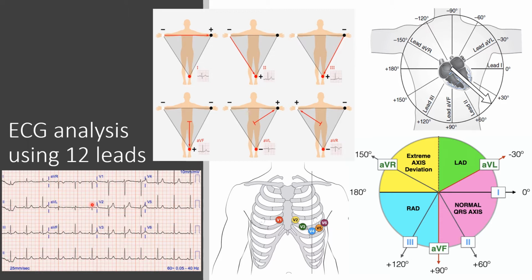The EKG can actually give you all of that information, and you get that graphic record right here. And this graphic record is going to tell you the direction and the magnitude of the electrical activity generated by your heart when your heart goes through all of these action potentials.